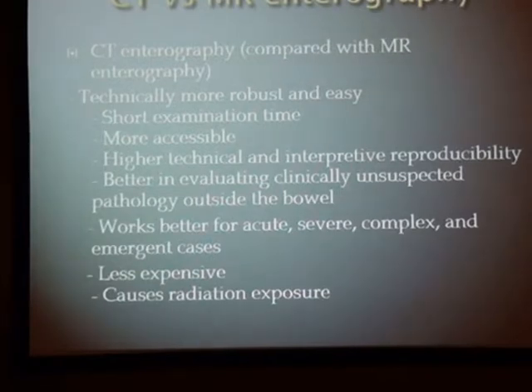CT enterography compared with MR enterography is technically more robust and easy, has short examination time, and is more accessible. There is high technical and interpretive reproducibility, it's better in evaluating clinically unsuspected pathology outside the bowel, it works better for acute, severe, complex, and emergent cases, and it's less expensive. However, it causes radiation exposure.